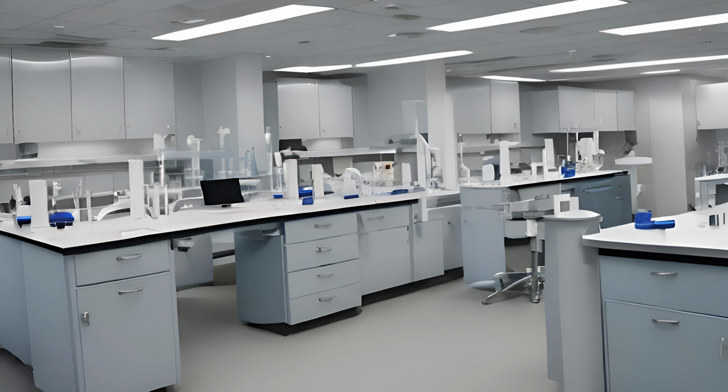To start with, an accession, or to accession something, is the process of recording in the order received. When you accession a sample that's been received in the laboratory, you are documenting that that sample has been received and then preparing it to go to the next location to actually be tested.